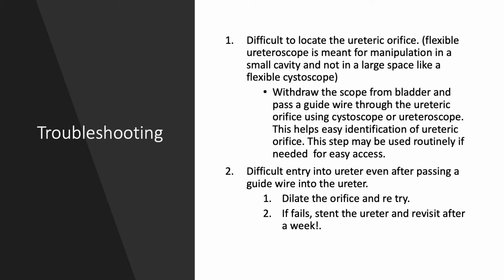We are doing ureteroscopies routinely and locating the ureteric orifices. Unlike a flexible cystoscope, a flexible ureteroscope is not designed for manipulation in a large space like the urinary bladder.